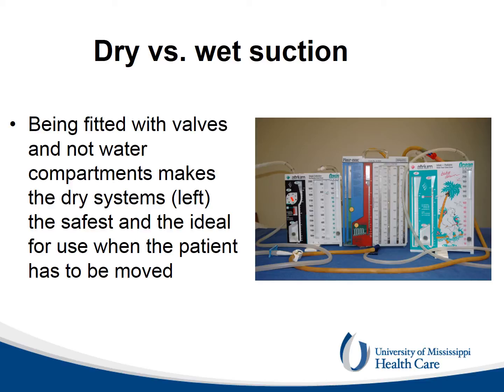The picture illustrates 3 different CDUs. One on the left has a dry suction system, while 2 on the right have a wet suction system, since the suction chamber and the suction regulator are filled with water. Being fitted with valves and not water, the dry system on the left is considered today by many the safest and ideal for use when the patient has to be moved often.